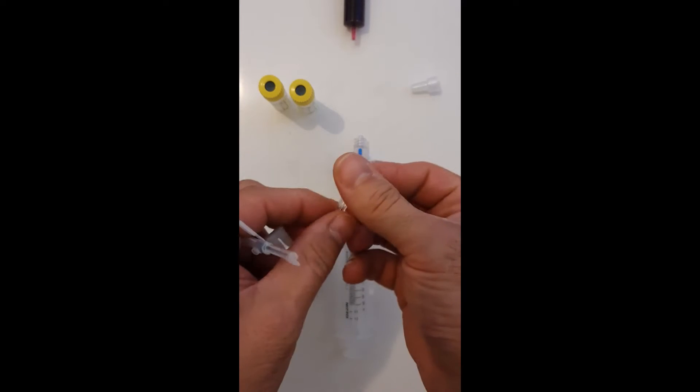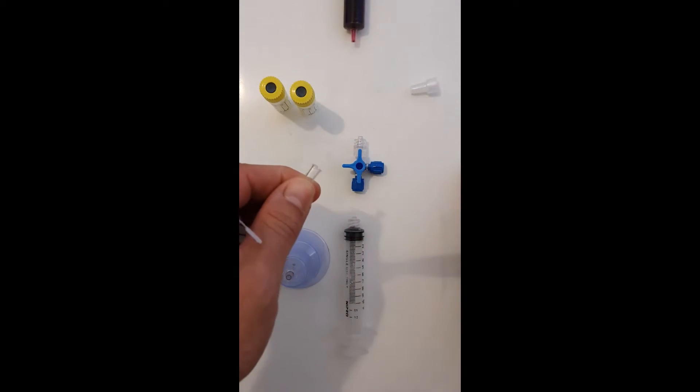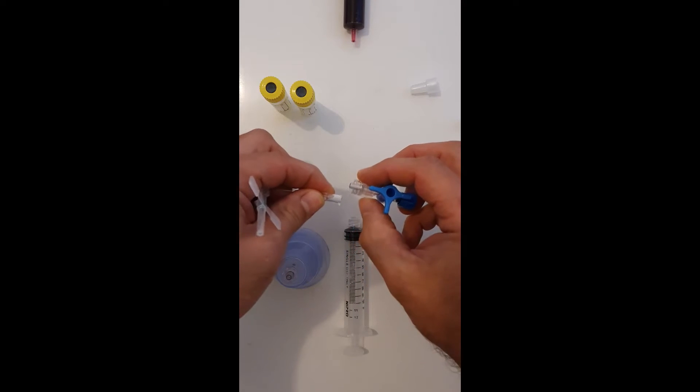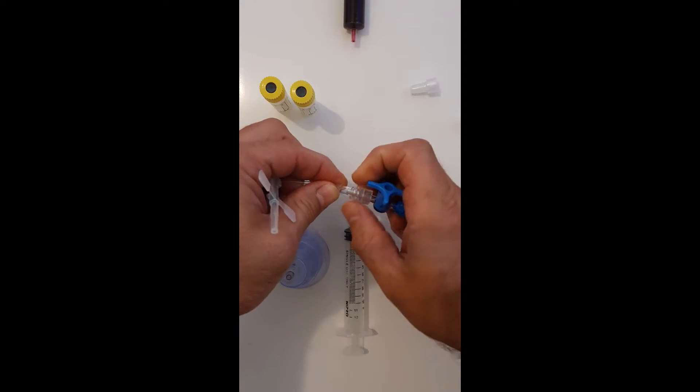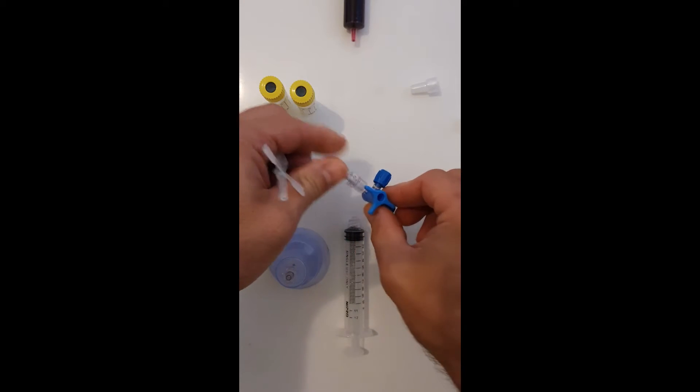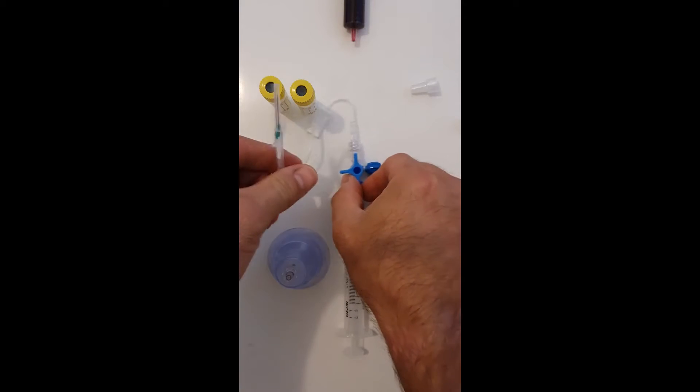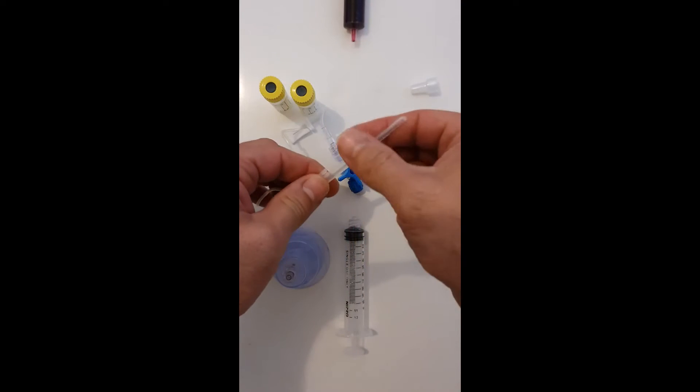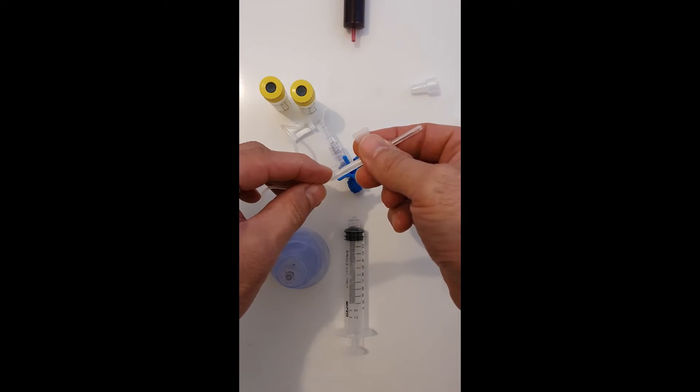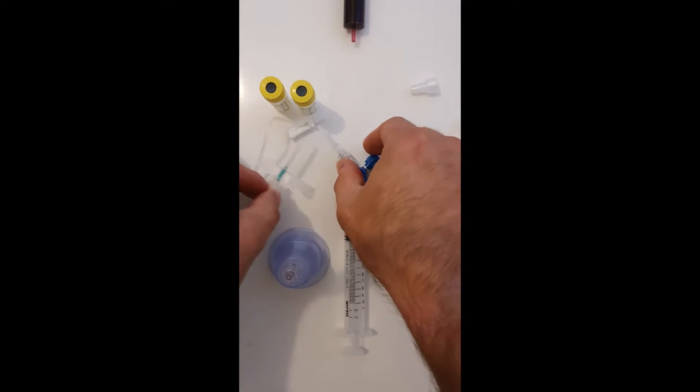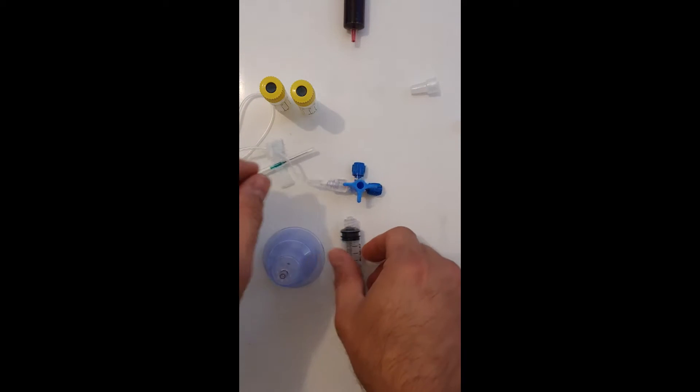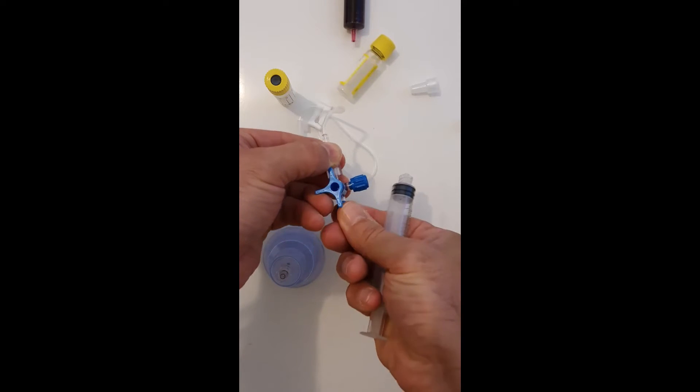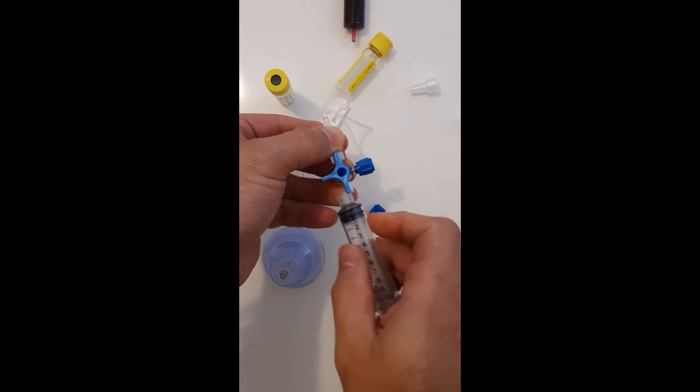What we're going to do is remove the end cap and attach it straight to the stopcock. As you can see here, there is a lock and also a tube lock here. The next thing we do is we attach the syringe.